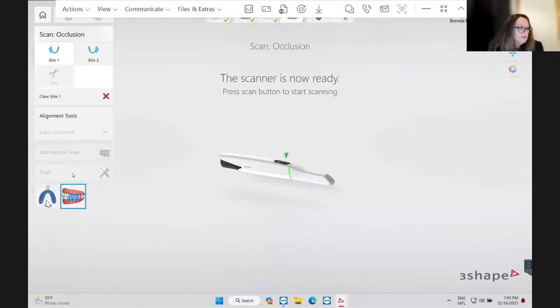So she was scanning a totally edentulous upper, it sounds like, for an immediate. Sometimes I take the regular Minnesota retractors, put them in a glove, and it gets slippery. But the important thing is you don't want to pull down or up. So I have it go up and out a little bit, and that way you can get in a little bit.